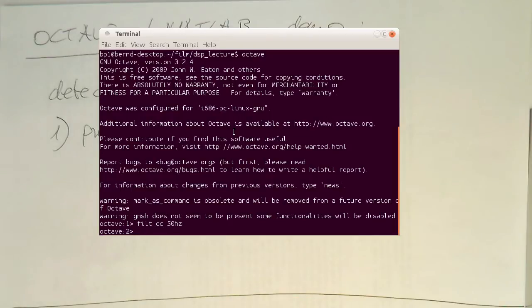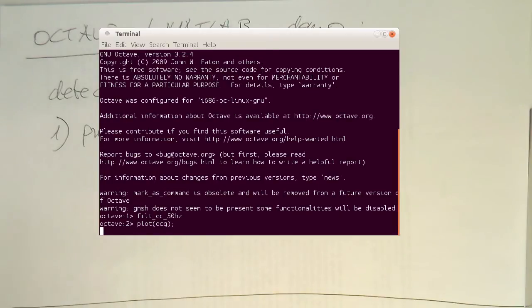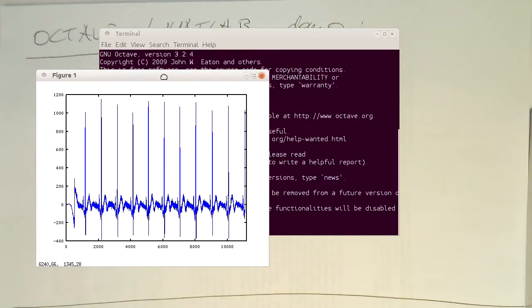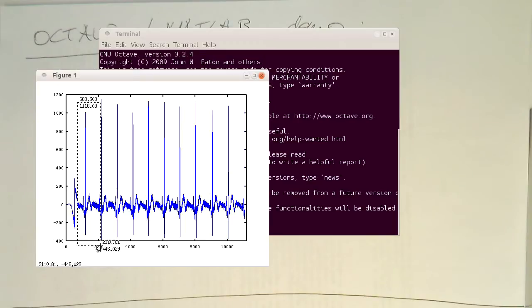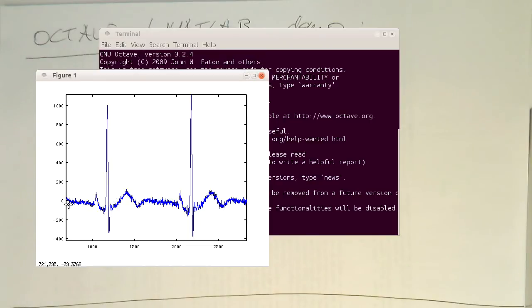And this generates a quite nice 50 Hertz free and DC free ECG. So if you zoom in here, that looks pretty clean. The only thing that's left here is some muscle activity, but otherwise that's clean and DC free.